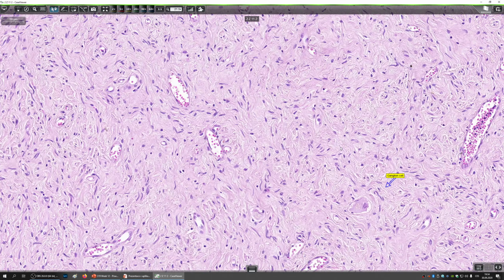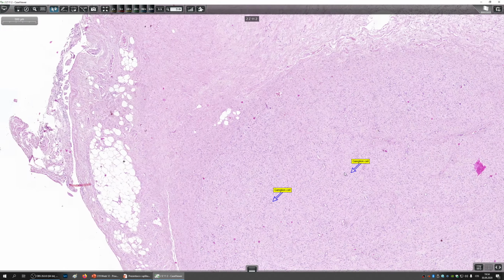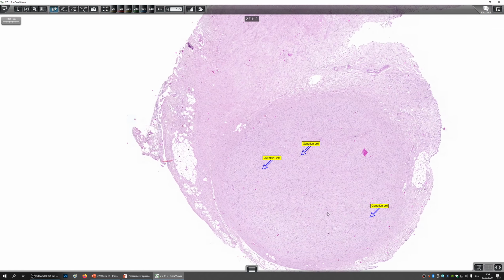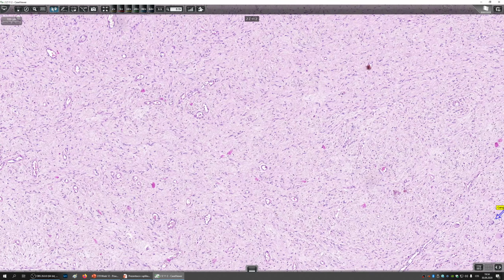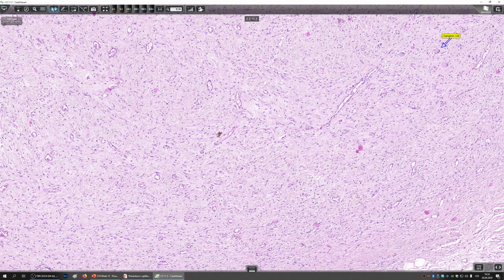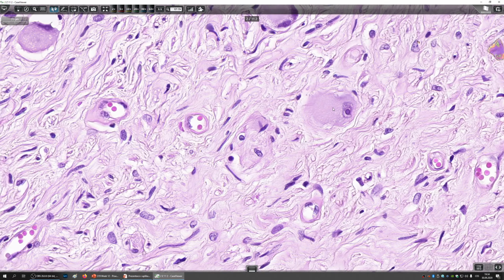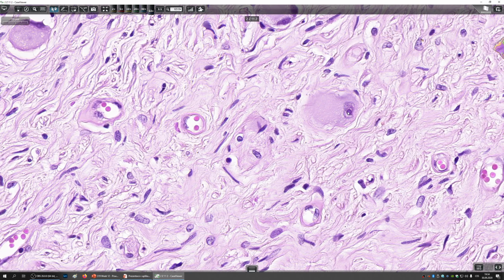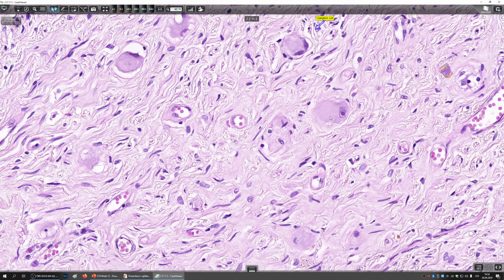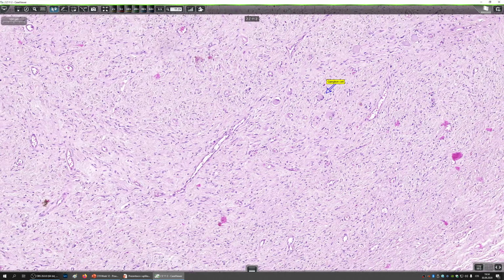So ganglioneuroma. This is quite easy to recognize. Spindle cells in a delicate matrix and ganglion cells, ganglioneuroma. Here this example has a lot of ganglion cells, so it's quite easy to recognize as such. Here are some more. Here is a nice group. This one also has a beautiful big nucleolus. This is a sign of just a very heavy metabolic activity and proteosynthetic activity.